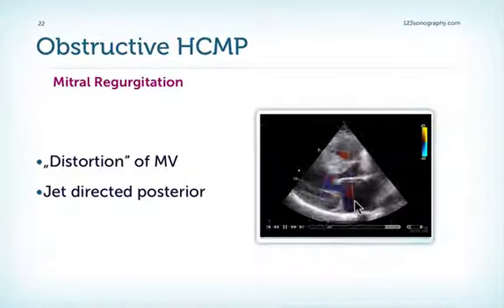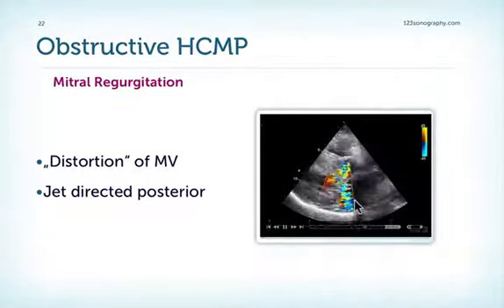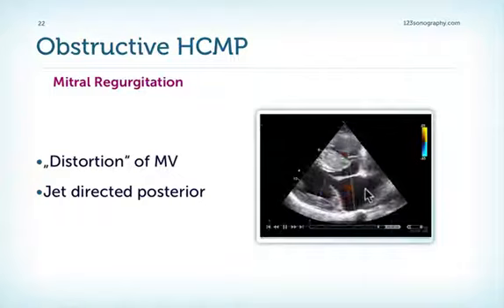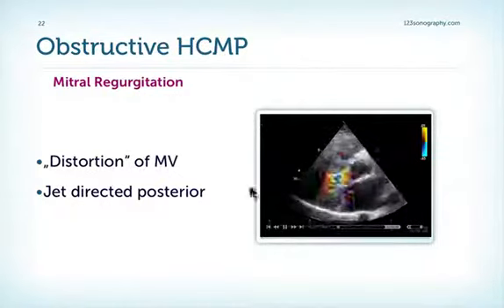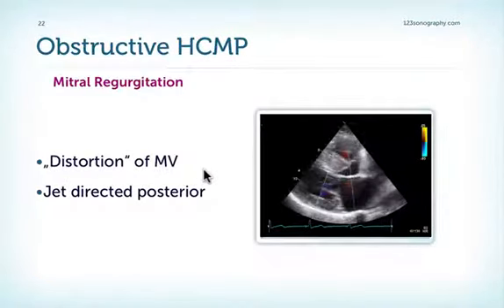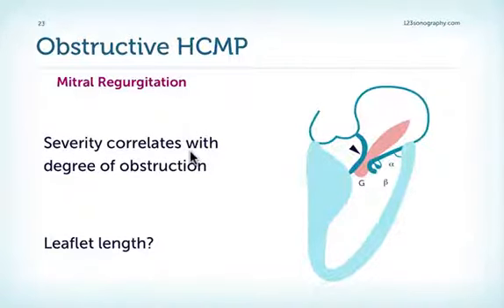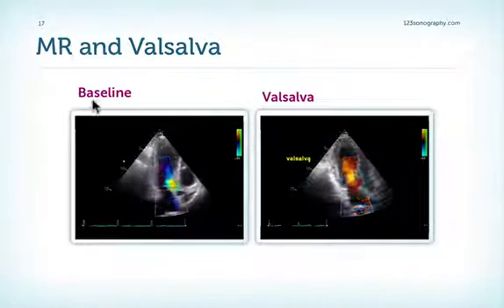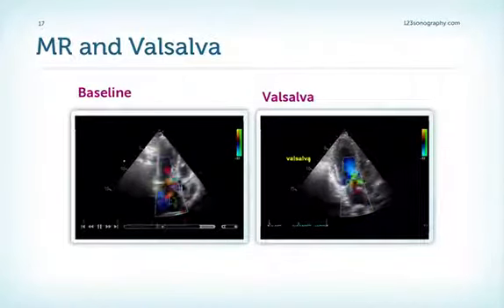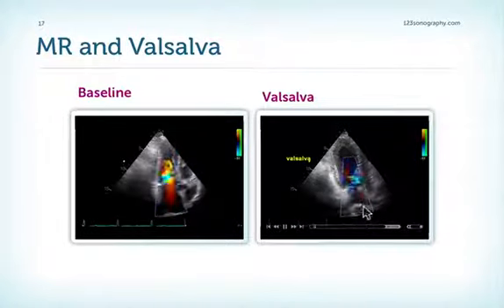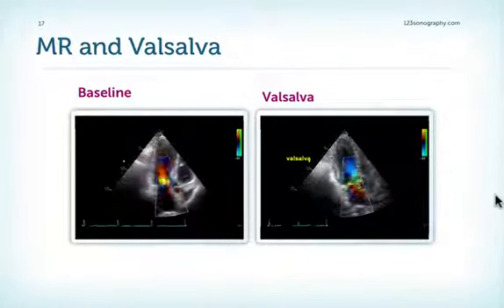Returning to mitral regurgitation in patients with obstruction: we have a jet directed posteriorly into the left atrium, caused by the systolic anterior motion and distortion of the mitral valve. The reason for regurgitation is the motion of the anterior leaflet but also the posterior leaflet — if the posterior leaflet is short it cannot follow the anterior leaflet, producing a coaptation defect. The severity of regurgitation correlates with the degree of obstruction: during baseline there is only mild mitral regurgitation, but after Valsalva maneuver with increased gradient, mitral regurgitation increases to at least moderate or moderate-severe.